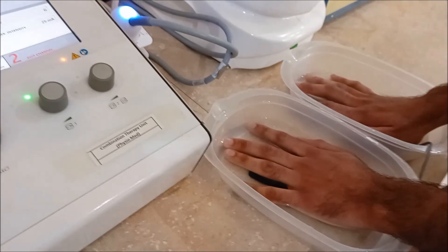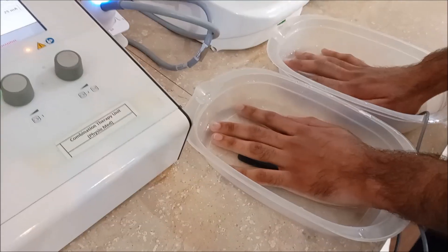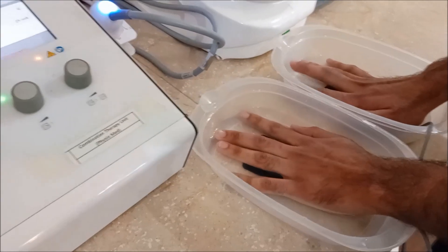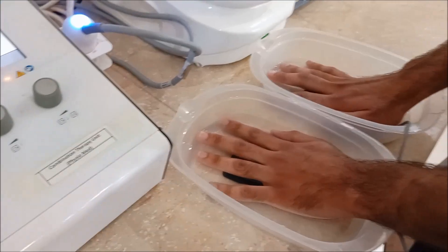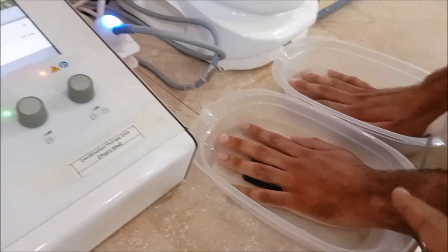If you want to treat your patients that have sweaty hands that are abnormally sweaty or feet, you can use the same setup to place the hands or the feet into the containers. This is a water bath along with the galvanic current.